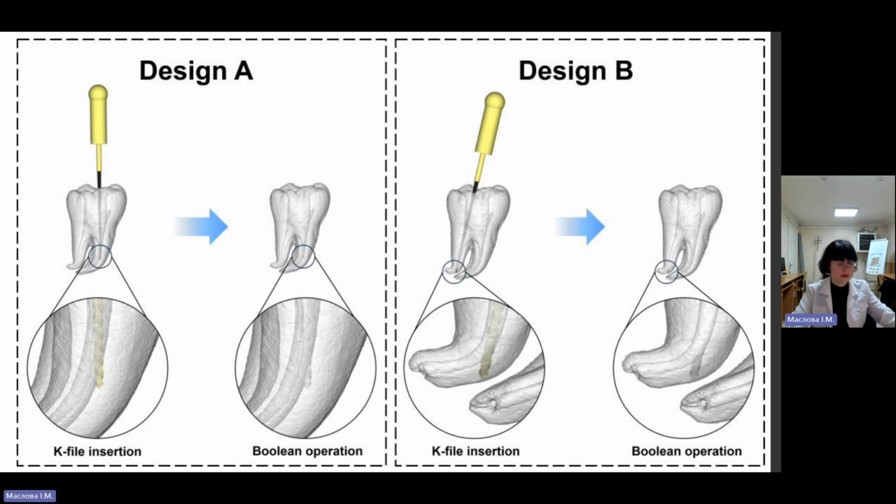You can see on the slide the variants of dental root anatomy, and please put your attention on the apical part. For these aims there exist different NiTi files, which can lead to correct root canal instrumentation without the appearance of different complications, such as fracture of the instrument or perforation of the root before the root curvature.